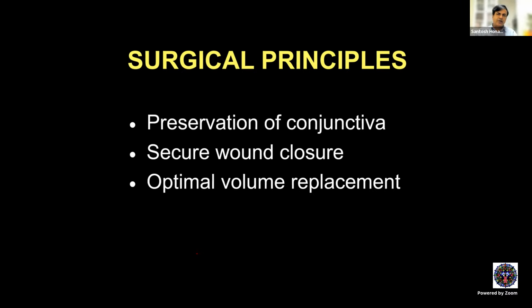So your peritomy has to be as close to the limbus as possible without unnecessarily excising conjunctiva. Try to avoid buttonholes to the conjunctiva. Try not to traumatize the conjunctiva or its edge using fixation forceps or being rough with it. You should treat conjunctiva extremely gently because that is the layer which you'll finally use to cover your implant.